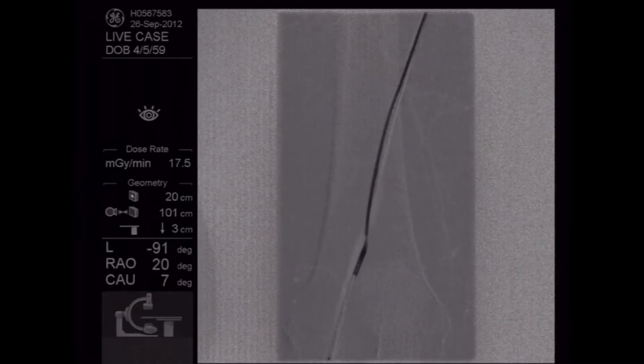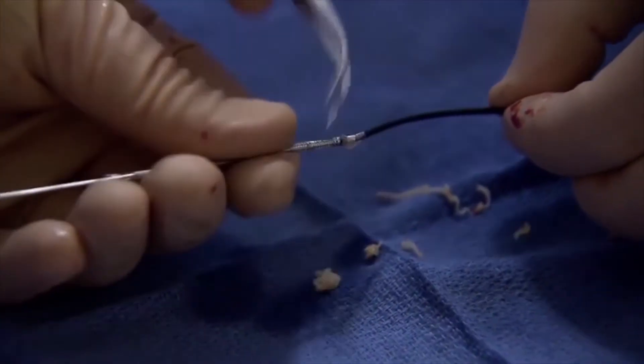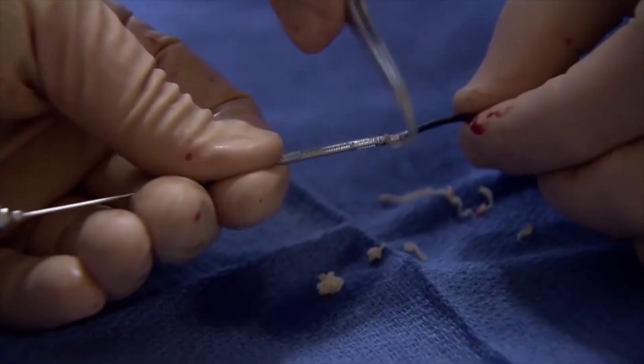We're going to zero in on the area of disease and really focus on that one — that's the one that's really causing flow issues. So let's do a full strength contrast and do a roadmap. Dr. Tonkin has gone down and is treating the next lesion the same way as before, passing the atherectomy device through the area of narrowing, going all the way around hopefully 360 degrees. You concentrate on the area that shows narrowing angiographically. You can see the little cutter actually acts like a gauge — you can tell how much plaque is sitting inside the vessel. They're removing some more of that plaque — this is more of that bacon and cigarettes we talked about earlier.